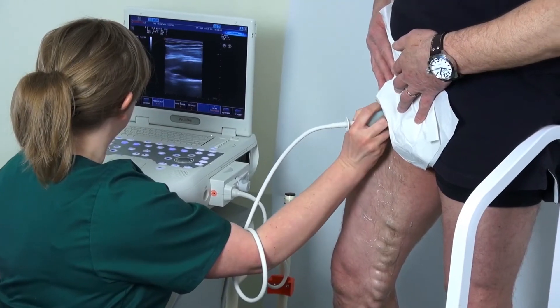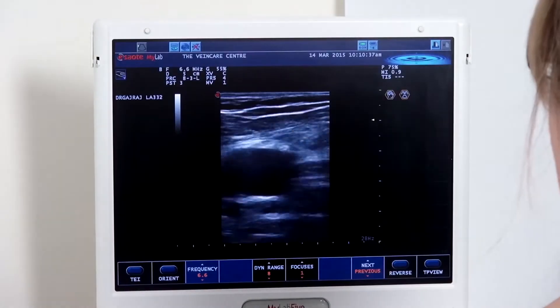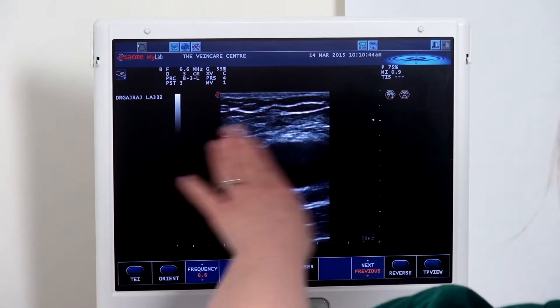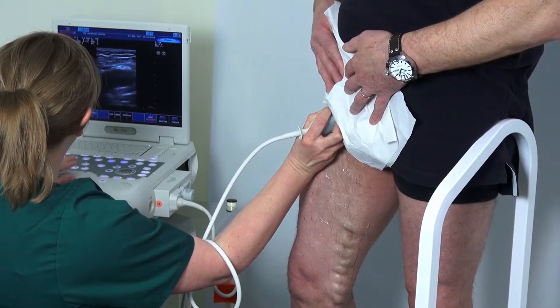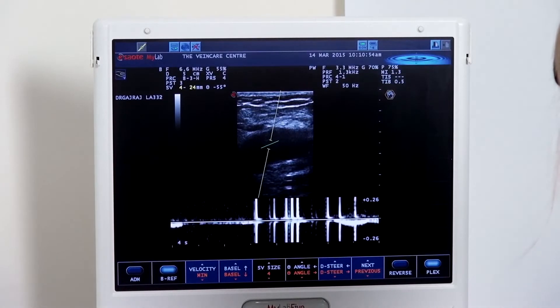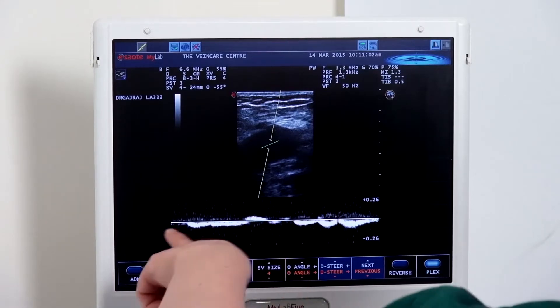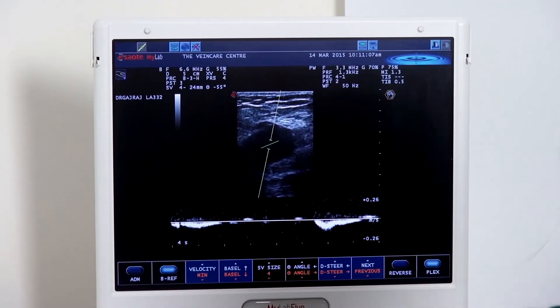Turning the probe into a longitudinal position — that is 90 degrees from the transverse position — this identifies the common femoral vein in longitudinal, with the patient's head, feet, front, and back oriented accordingly. We need to press the pulse wave button and centre the sample volume in the middle of the vein. You can see that the angle is appropriate to the vessel walls, and this is going to give us our best Doppler signal. The trace is currently running a normal venous trace with breathing movements noted.